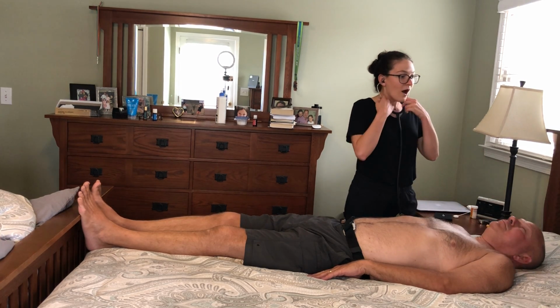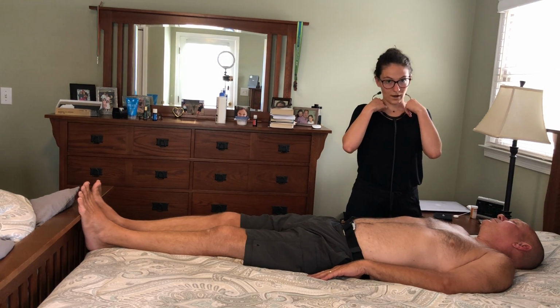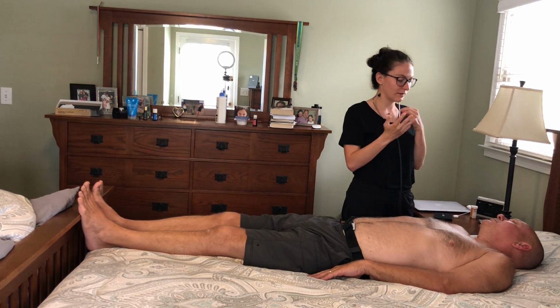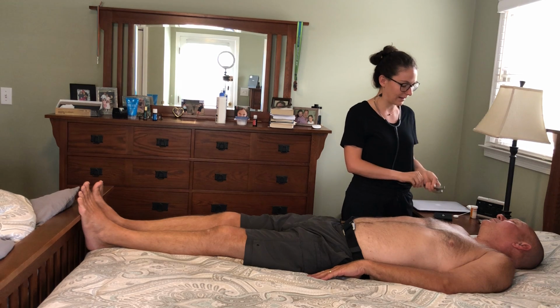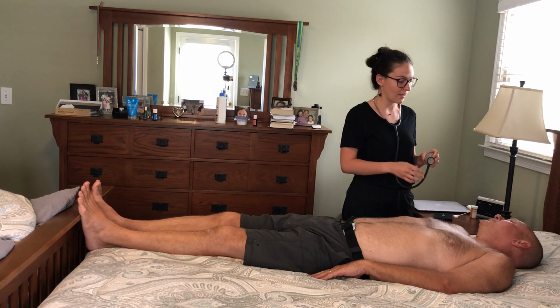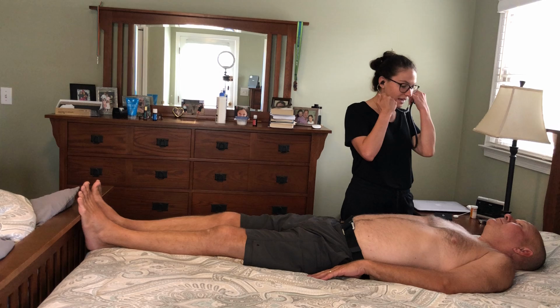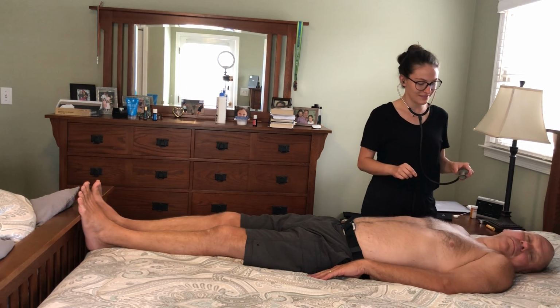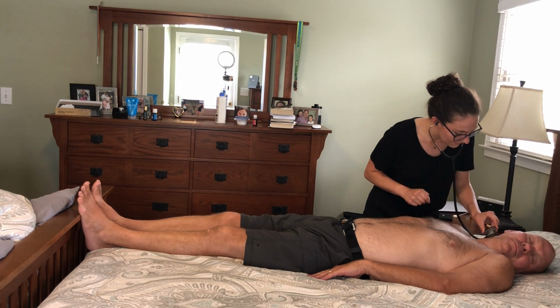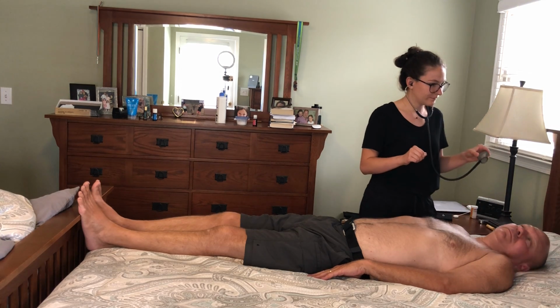Okay, thank you. Okay, so now I'm going to listen for carotid bruits in your neck. So I'm going to listen on both sides of your neck in 3 different spots with the bell of my stethoscope. So could you take a deep breath and let it out and hold it for each side? Okay, so look to your left, please. Okay, thank you.